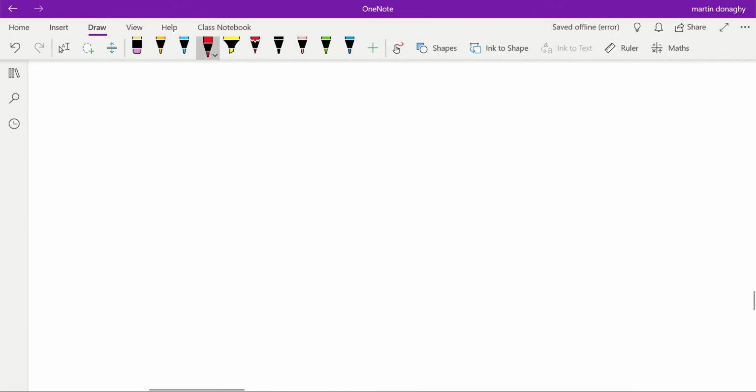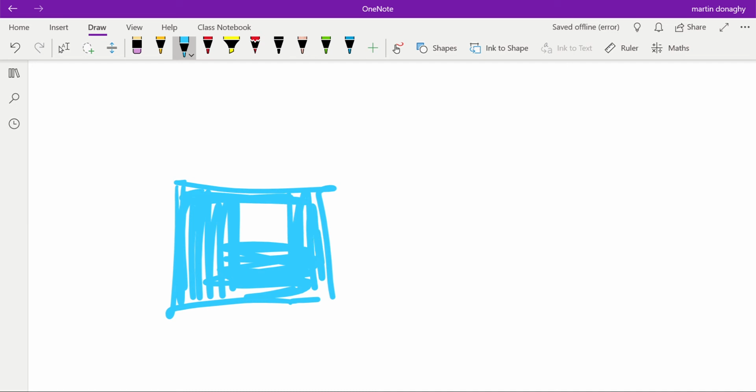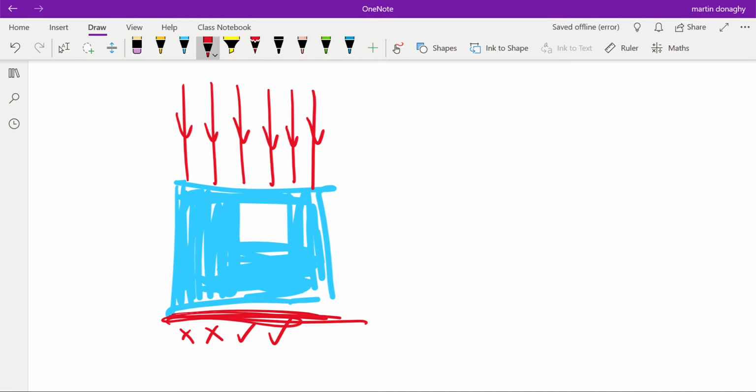They send X-rays. So let's say we had just a solid box. Here's a box, but there's a hole in it somewhere, but we don't know where that hole is. What we could do is send X-rays in like this. Those X-rays have to be collimated. By that we mean in columns. They are all straight, parallel to each other. And then we put a little detector down here. What this detector would detect is more X-rays underneath the hole, less here, less here. So we could have a little idea that that hole in that object is somewhere above here.